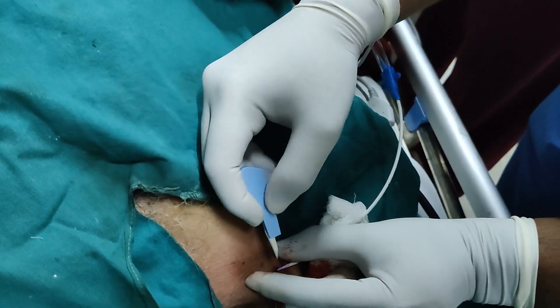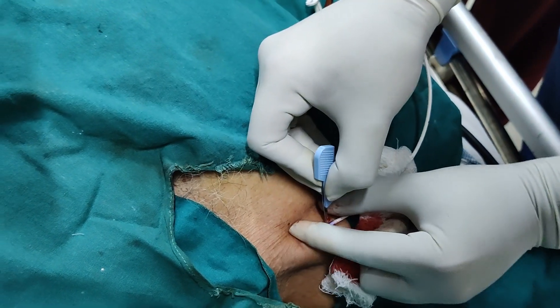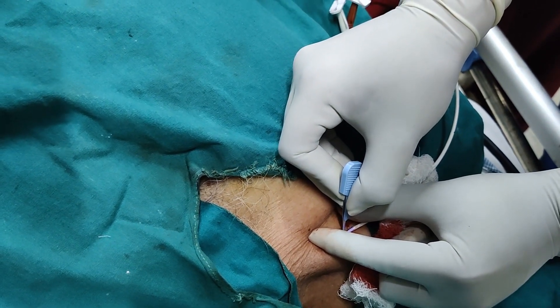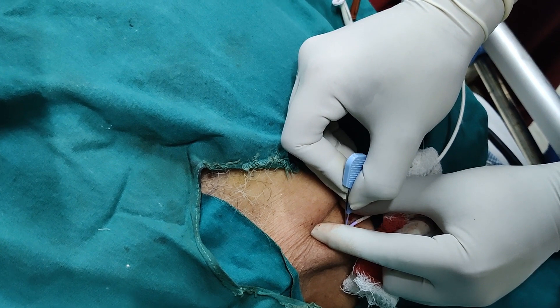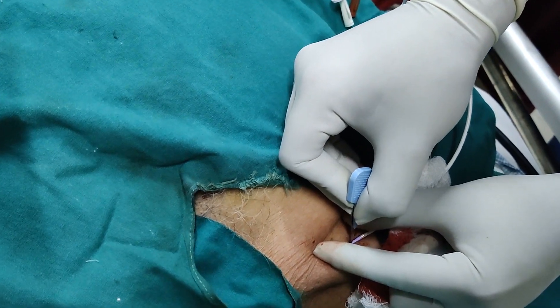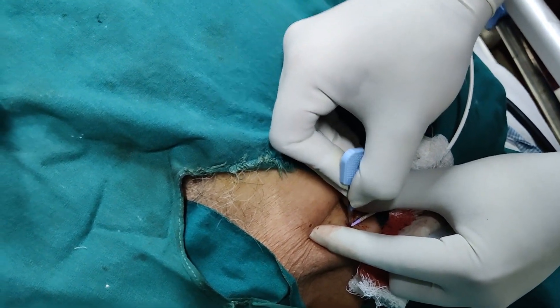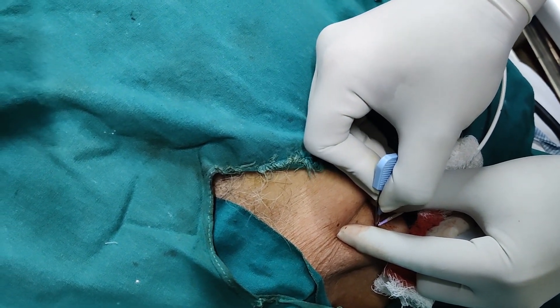Using the scalpel, make a small stab incision of about 4 mm into the skin insertion site, avoiding contact with the guide wire, to enlarge the site and allow it to accommodate the larger diameters of the tissue dilator and the catheter.